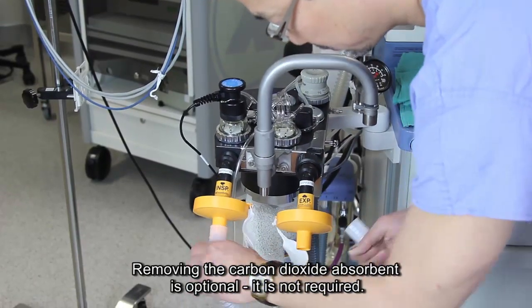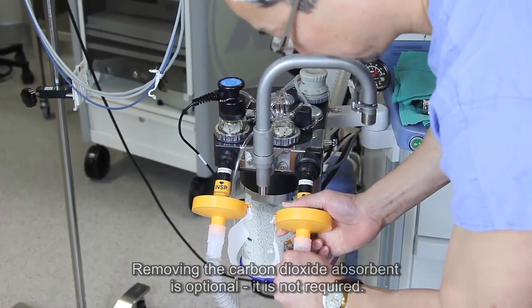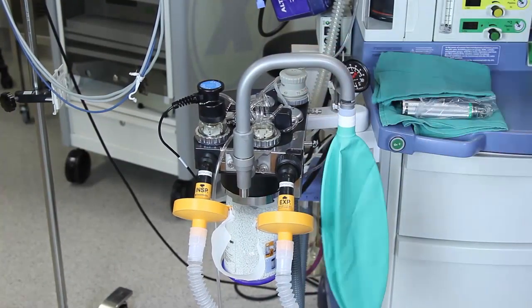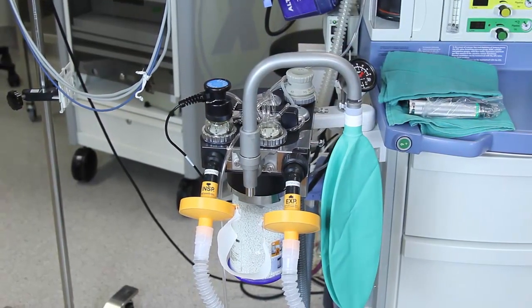After that, I'll be obtaining a new anesthesia circuit and a new anesthetic bag, or breathing bag.